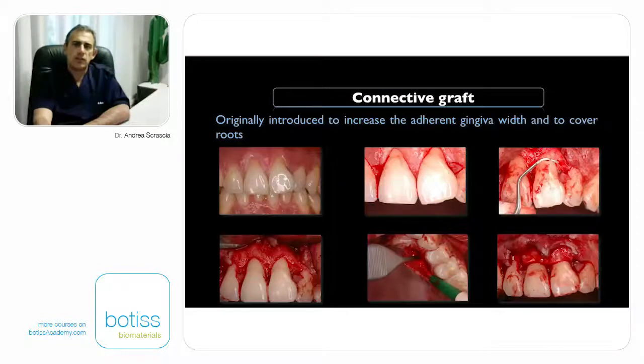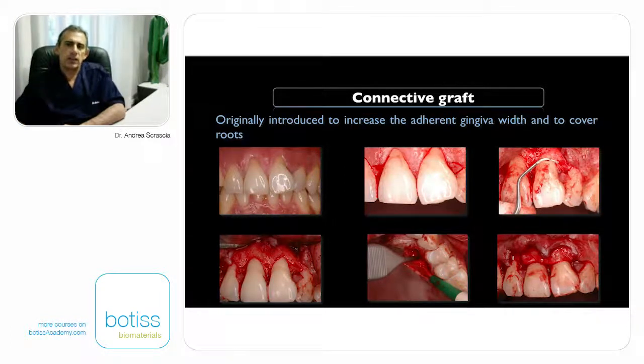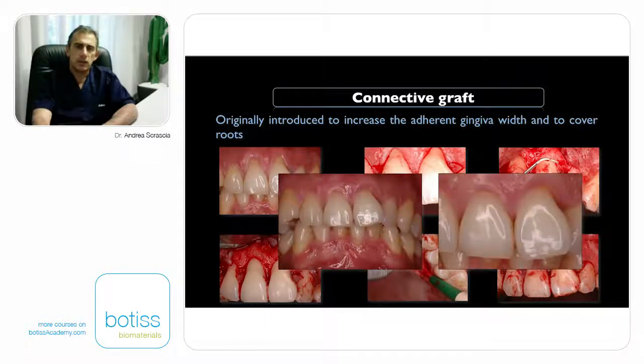For the angular incision, I can present a clinical case, and in this clinical case, showing connective tissue graft to treat multiple recession in the central incisor, and a Miller third class on the 2.1 incisor with angular incision technique in the donor site, executing a flap with papilla preservation. And this is the result after 8 years.